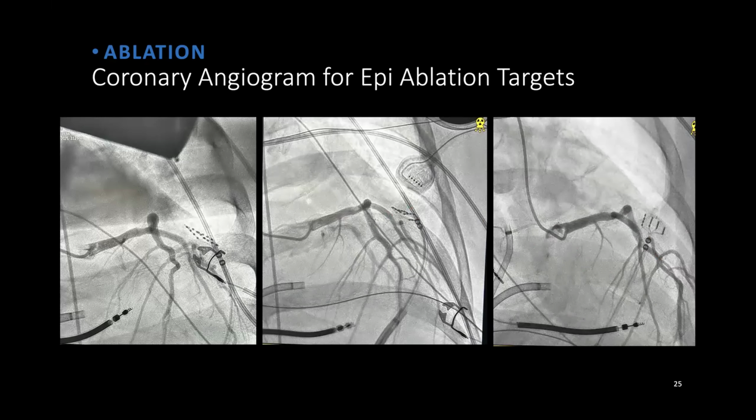But regardless, off the top of our heads, it was like, okay, we are not seeing any interesting diastolic signal epicardially. We are not seeing any interesting signal endocardially. So we already knew we were talking about a transmural or intramural kind of isthmus, which complicates everything much more. But regardless, we were trying to do a sequential ablation, right?